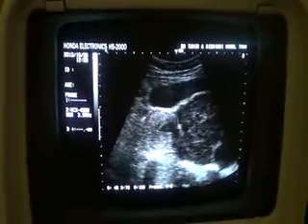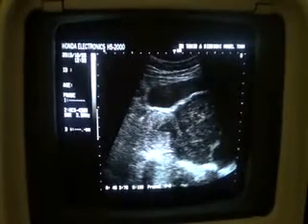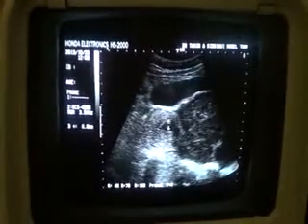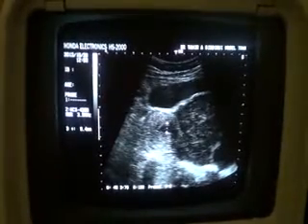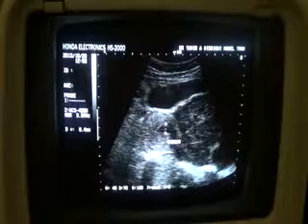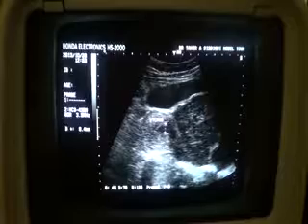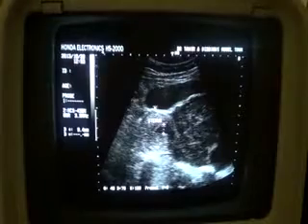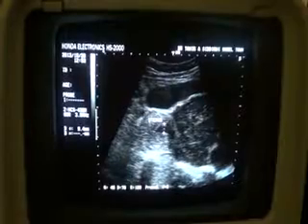This is the endometrial canal, this is the fundal region, this is the posterior myometrium, this is the anterior myometrium, and the endometrial canal is dilated up to 9.4 millimeters and is filled with fluid. This area is the uterus, all of this. You can see a thin rim of fluid anterior to the fundal region myometrium, this area. This is the outer capsule.